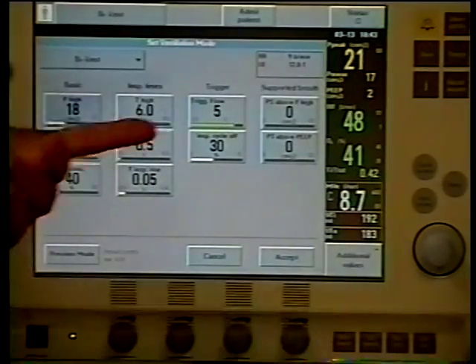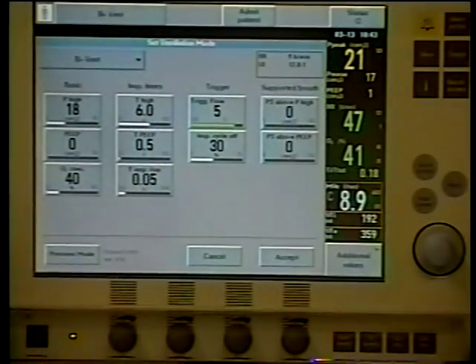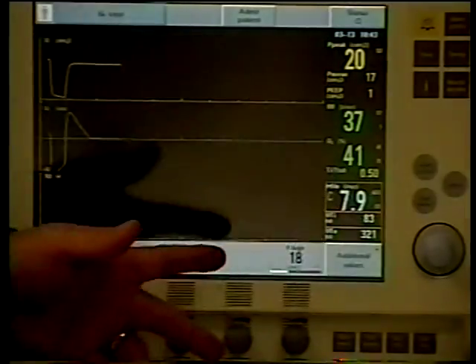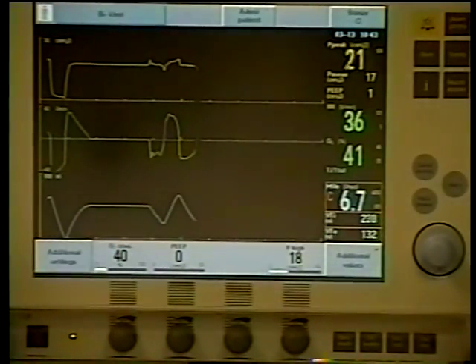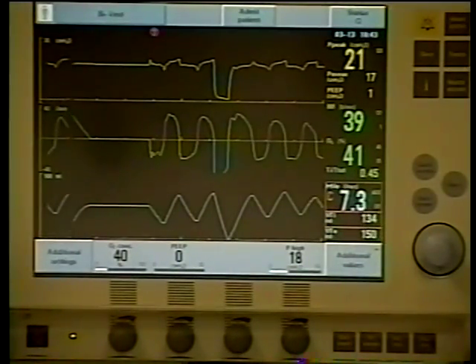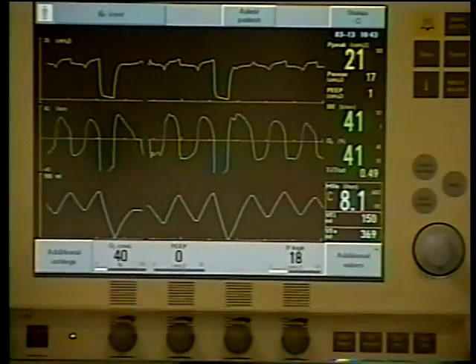So keep that in mind, because the physicians sometimes see that number and say, whoa, they're breathing 40 times a minute. And you say, well, they're breathing only 30, but we have the releases set at 10. So really those other 10 aren't counting in the actual respiratory rate. But they'll look at that number and quickly say, no, the patient's not tolerating it. Just tolerate those higher respiratory rates a little bit more in Bivent than you would in conventional. Because this is very similar to oscillatory ventilation, where the patient's actually providing the oscillation through spontaneous effort. So a rapid spontaneous effort is not a terrible thing.